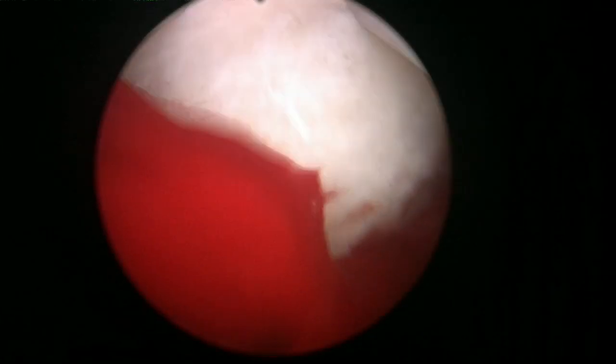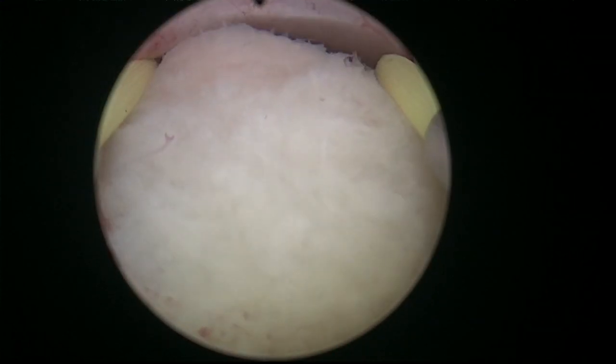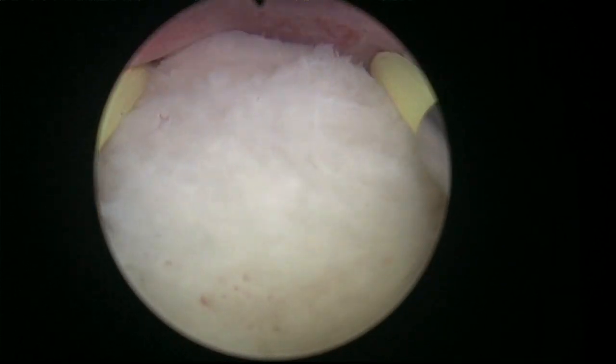Now this is cutting. As it's monopolar, it will only cut when it's in contact with the capsule. You know what I mean? The current has to go through the adenoma and then into the capsule of the prostate and then out through the electrode in the skin, no? So now I'm bringing the piece out through the meatus. That's it.